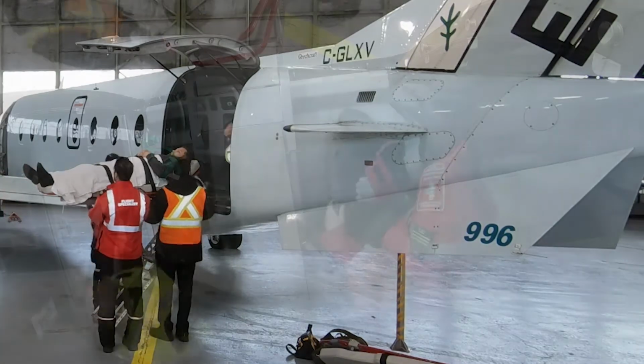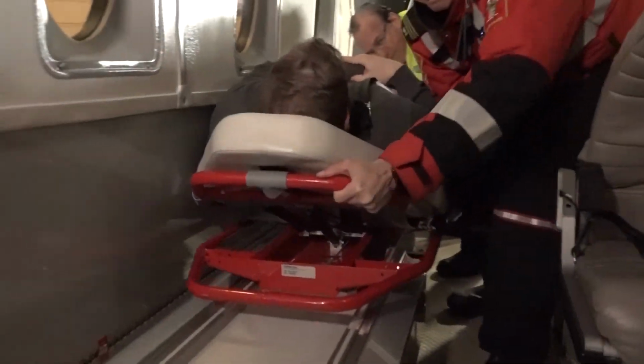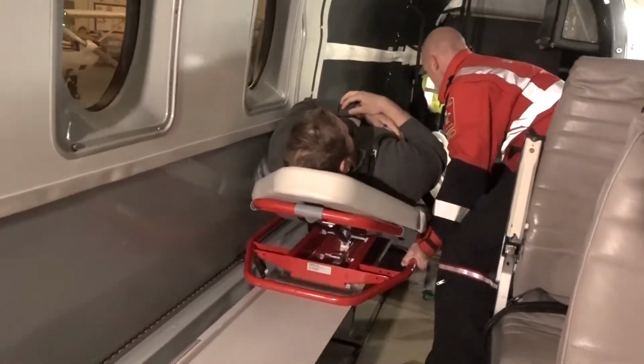10. While this lift is occurring, one of the medical flight specialists and the 2nd pilot will then move into the aircraft to assist with sliding the aerosled along the 90-degree turn of the track and into the life port station, locking the aerosled into place for flight. 11. This process is reversed when unloading a patient from the aircraft.